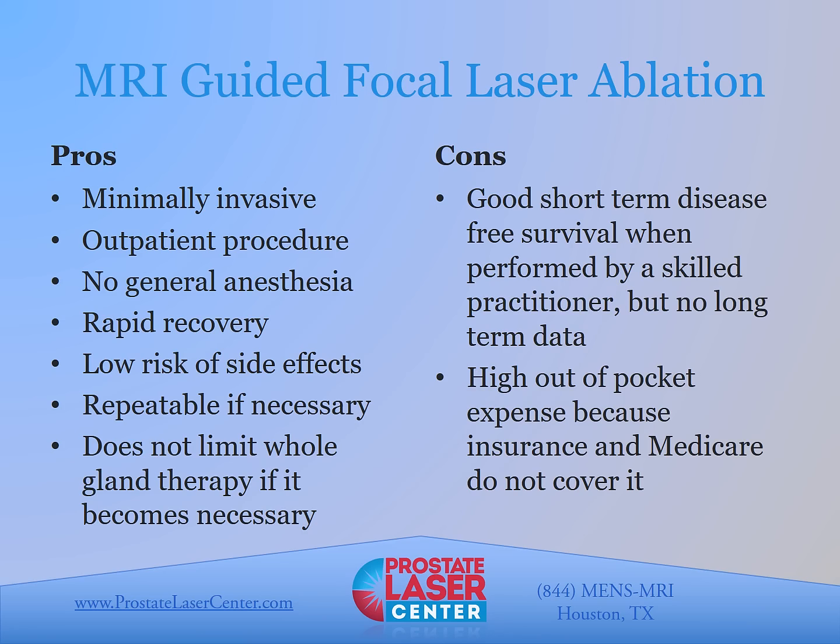The disadvantages include that while we do have good short-term disease-free survival data when it's performed by a skilled practitioner, we don't have long-term data demonstrating improved overall survival. The technology hasn't been out long enough for that data to be collected. Furthermore, there is a high out-of-pocket expense because insurance and Medicare do not cover it. Currently, practitioners charge in the range of $20,000 to $32,000 for this treatment.